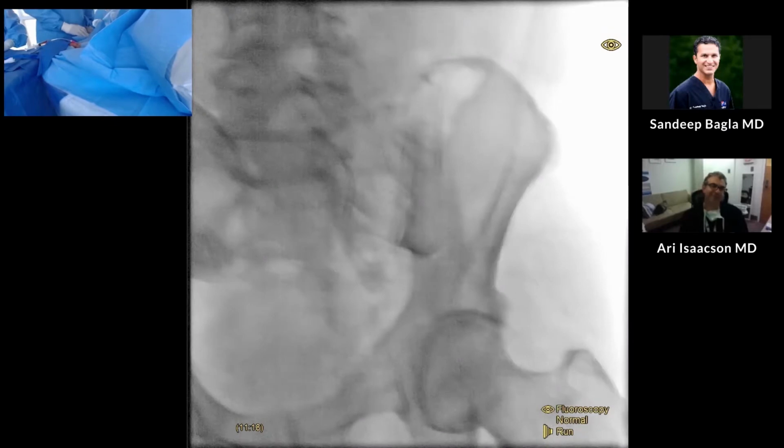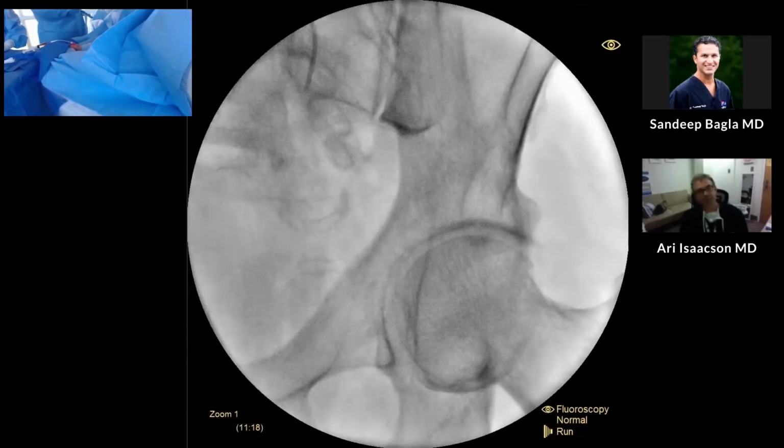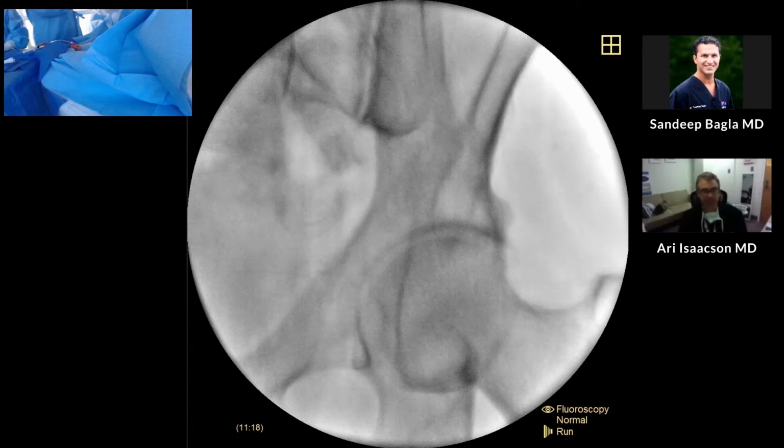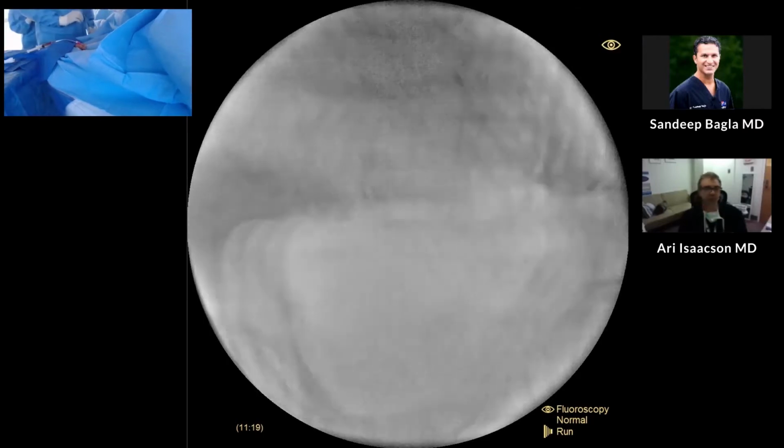Kathy, would you mind just turning the wheels for me one more time on there? Just turn them. Sonny, this is a radial PAE you're doing, huh? Yeah, so we're going to be doing a radial PAE. And how did you decide to use your radial access for this patient?